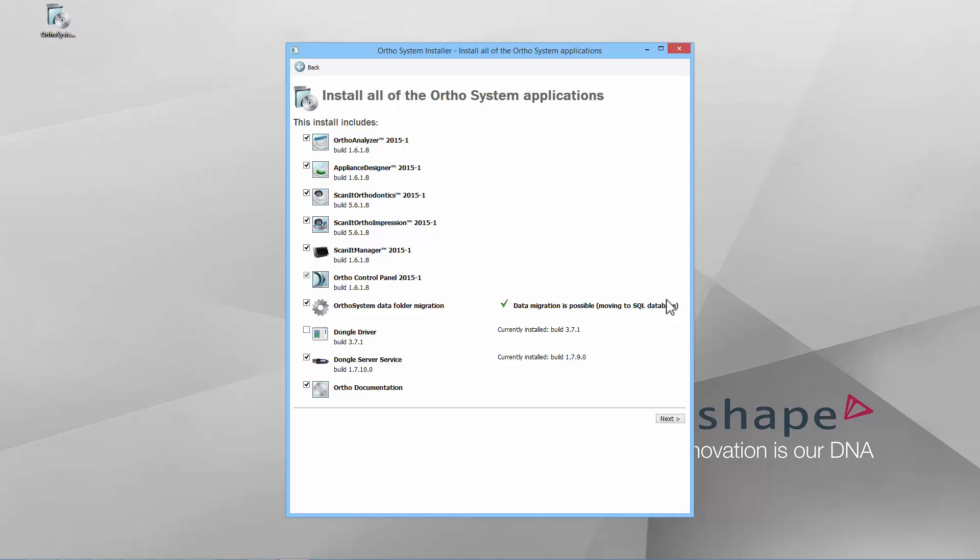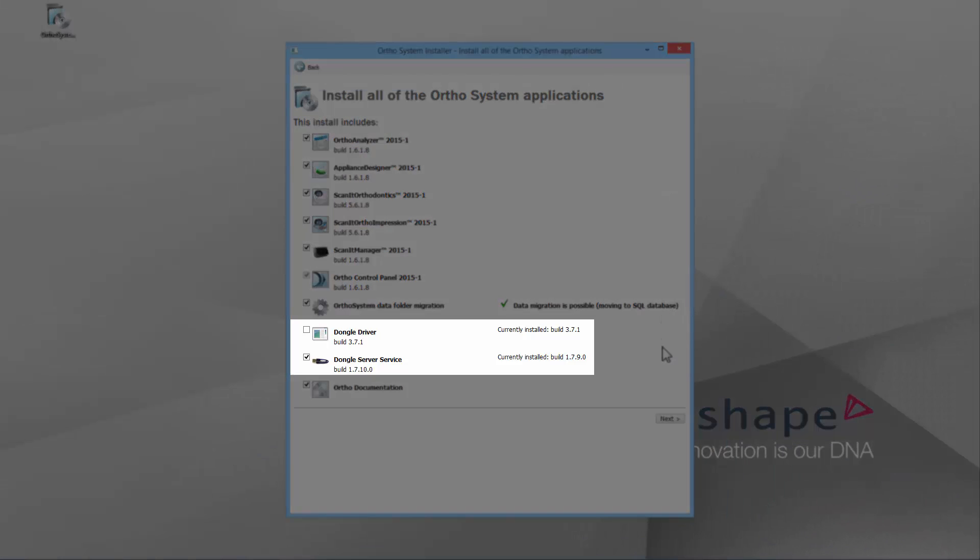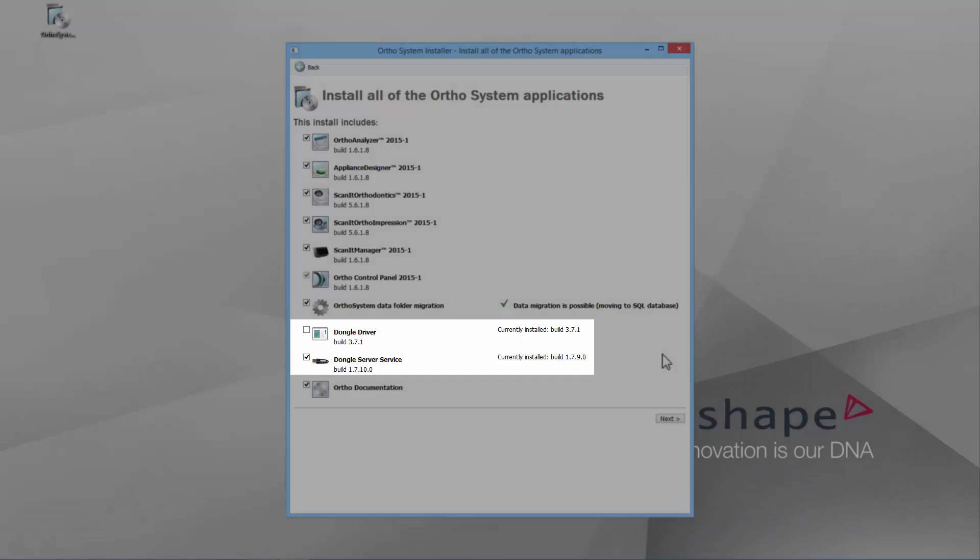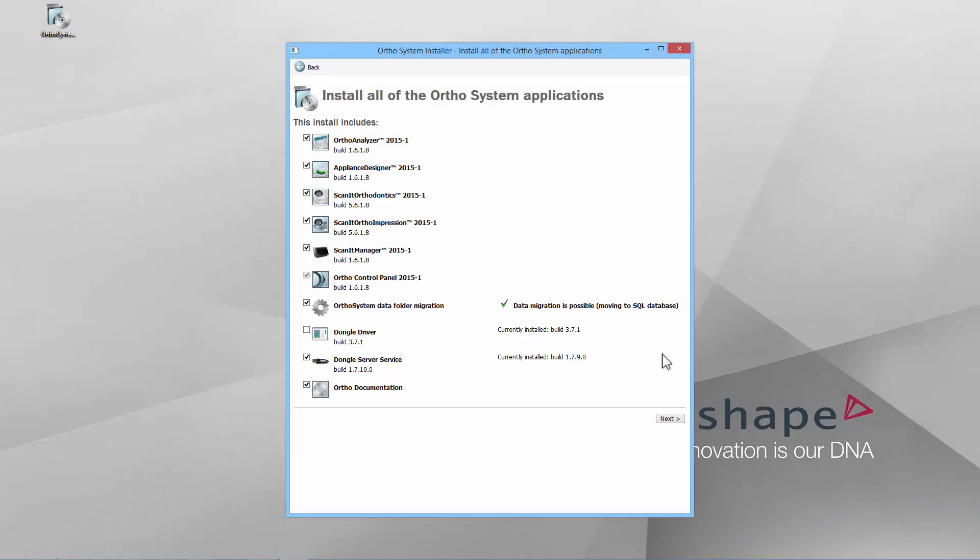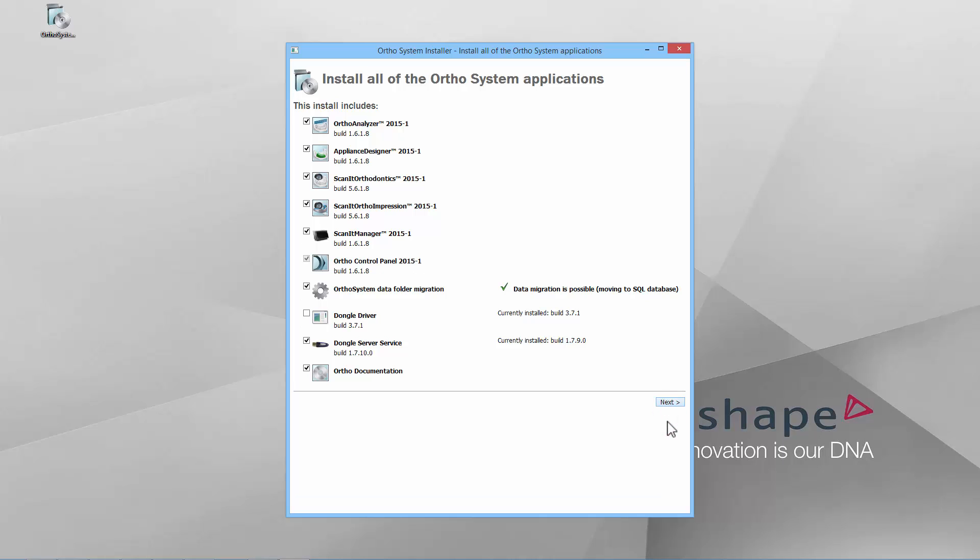Notice that if you have installed any 3Shape software before, the current versions of the DongleDriver and the DongleServer service will show up and the new version, if such exists, will install automatically. When you click Next, the installation process will start and take a few minutes. Wait until it's finished.